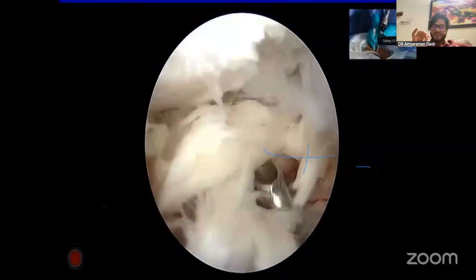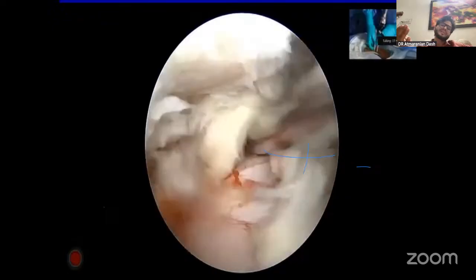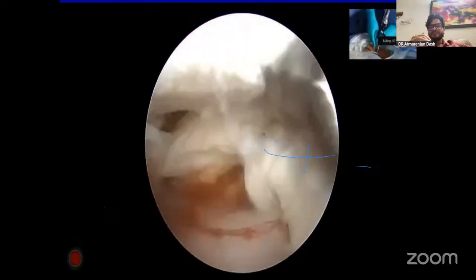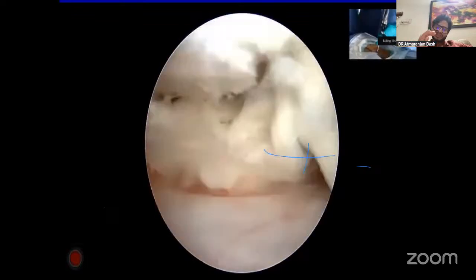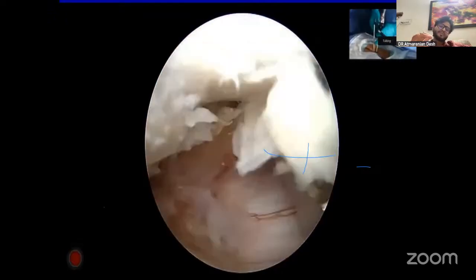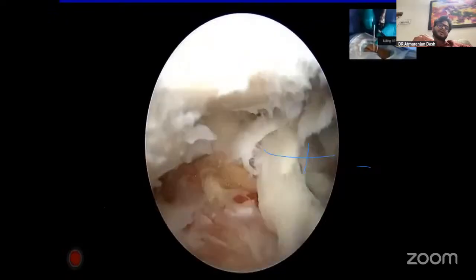The advantage of biportal endoscopy is you can access a few extra millimeters of the lateral recess, which is not possible in microscopy. So the few extra millimeters of flavum removal helps us clear the complete lateral recess. We clear almost 5 mm extra of the lateral recess, where we find the blind spots.